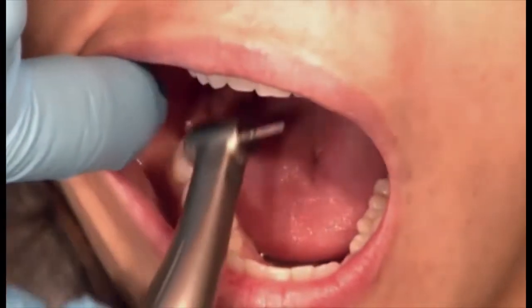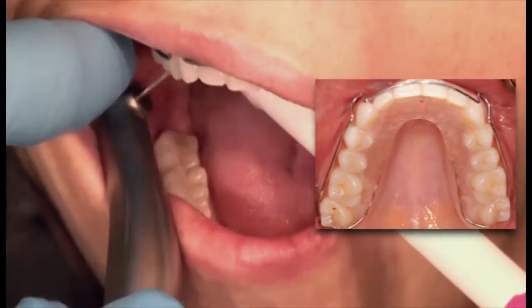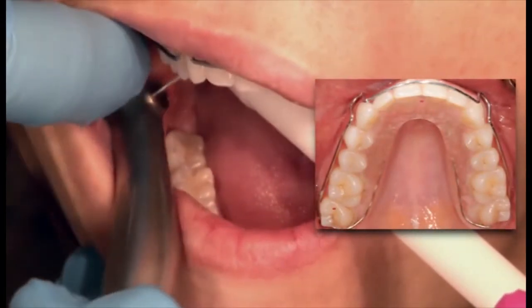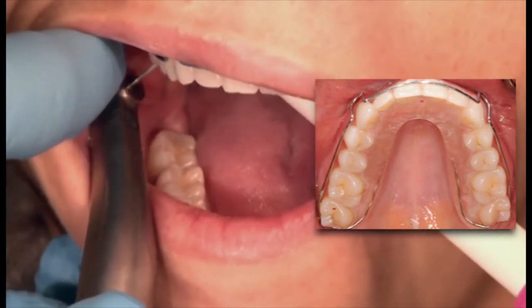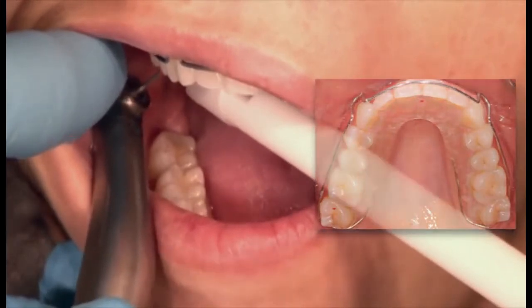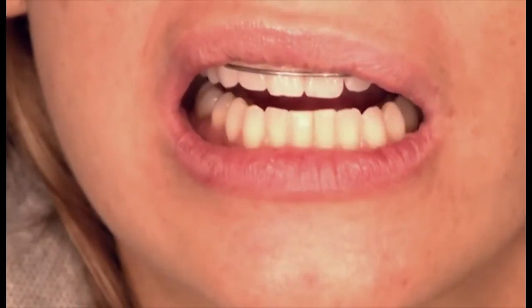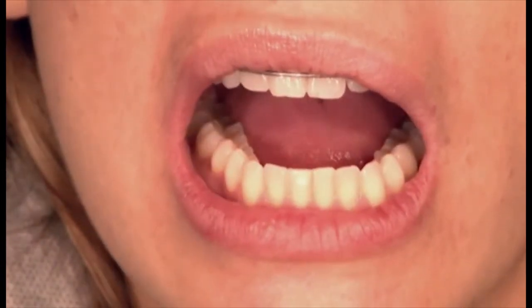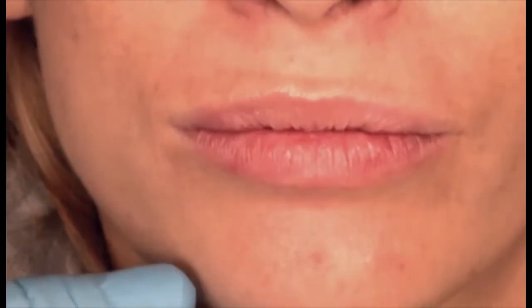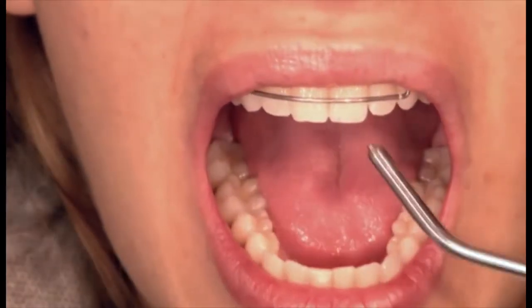I'll go to the top, and we'll just reduce the tooth in the central fossa. Okay? Once I've reduced the tooth in the central fossa, now nothing touches. Is that correct? Nothing touches. Tap up and down. It doesn't touch. We'll go back and we'll mark the platform in the front.